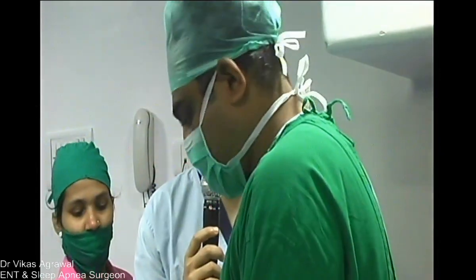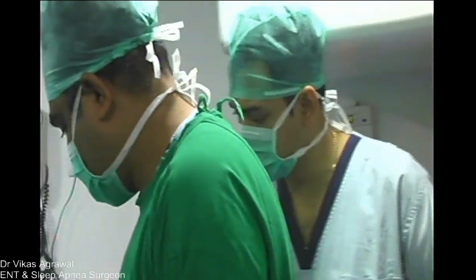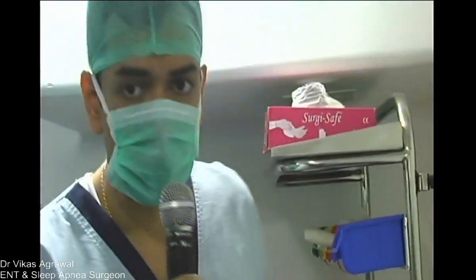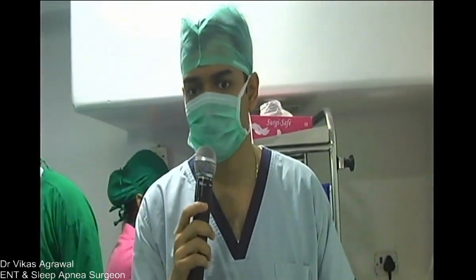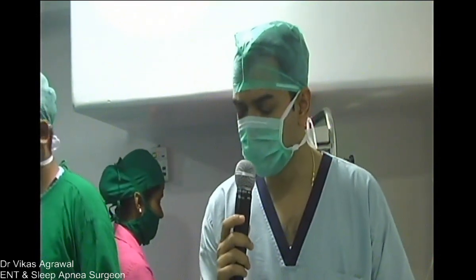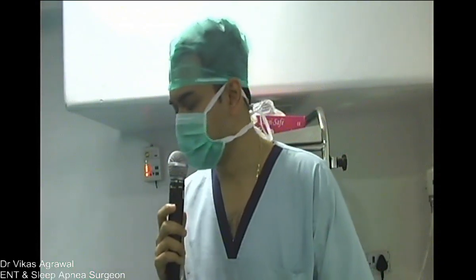Another metric that one can judge while looking at the sleep study is the oxygen desaturation index, which also gives a true picture in terms of judging the severity of the disease. If somebody is having oxygen desaturation where the oxygen levels are not falling so low, say they are in the late 80s or early 90s, I would not be worried too much about that patient in terms of cardiovascular morbidity. Two patients with the same AHI can have different oxygen desaturation indexes.